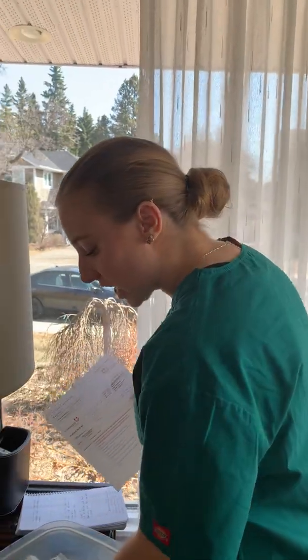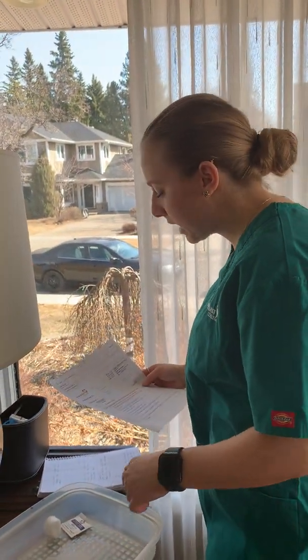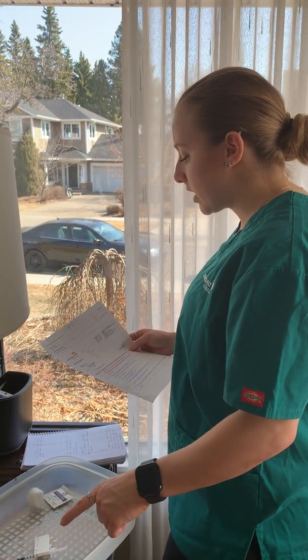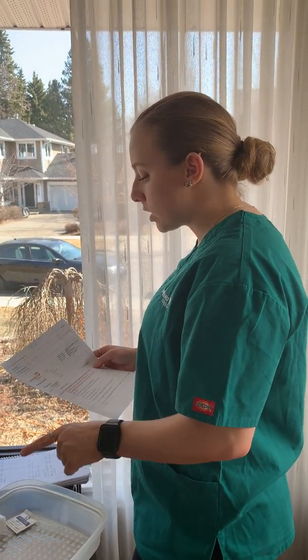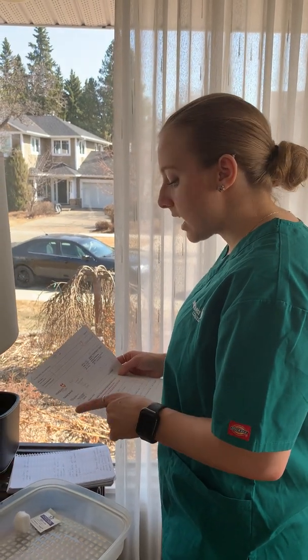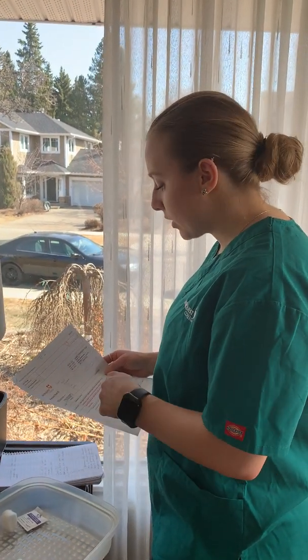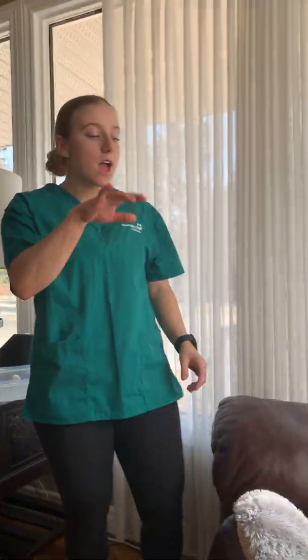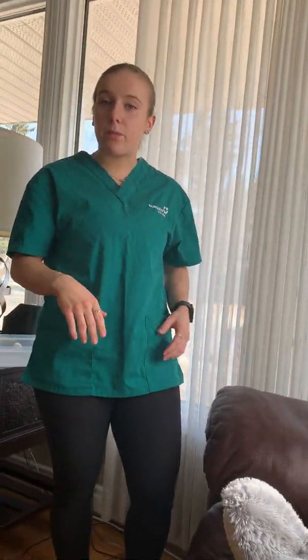So really quickly, we're checking the medication one last time. So we have the right patient, Roger Stevenson, right medication, Humulin R, right dose, 0.12, right time is 8 a.m. on both, and right route subcutaneously on both. After that, I will wash my hands. I will walk into the patient's room, ensuring that they have privacy. Bed is in the lowest position, side rails are down.